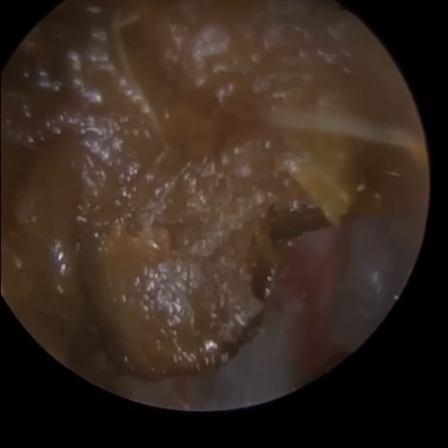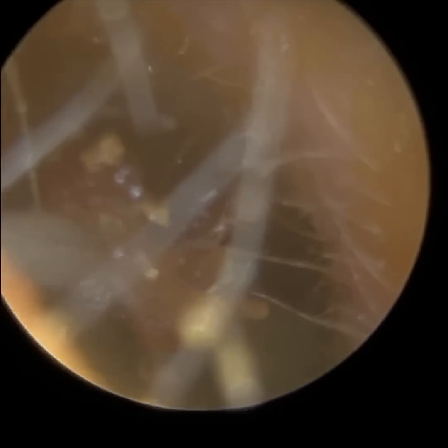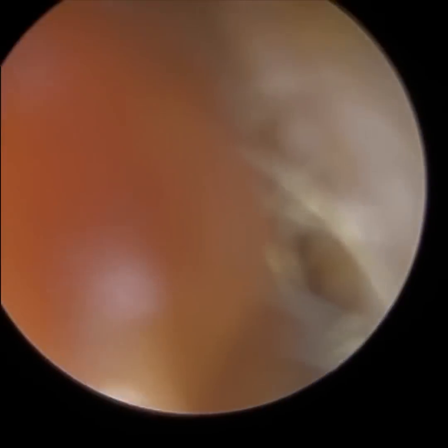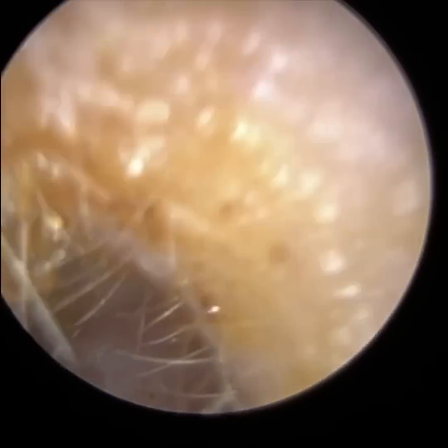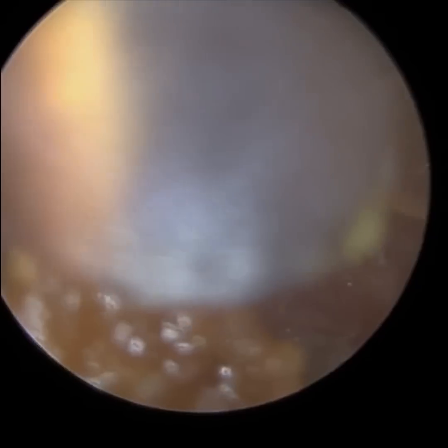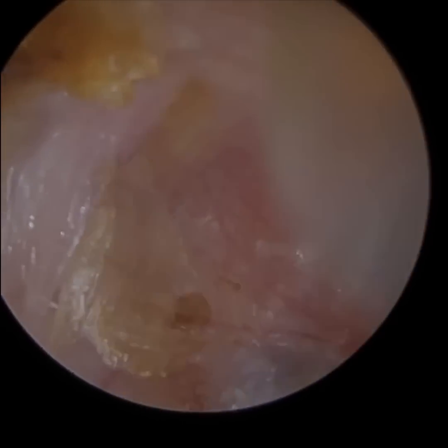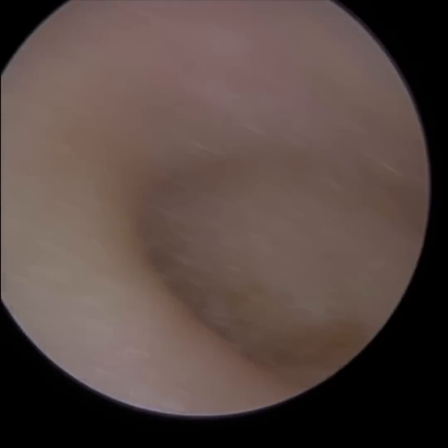You can see there's still a bit of wax that's separated from that main piece that I just extracted. So we're going to just peel this away. And we're going to bring it out of the ear. And once I have, you're going to see those hardened wax plugs that are stuck on the eardrum. So I'm going to stretch the ear again. There's some dead skin wax on the posterior canal wall. So at this stage, the patient can hear significantly better because the occlusion is removed. So there's some skin there, which I'll remove a bit later.